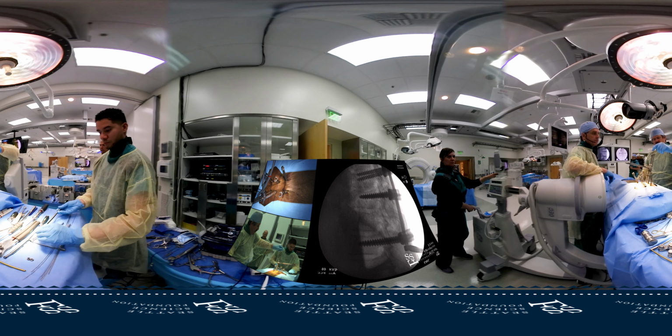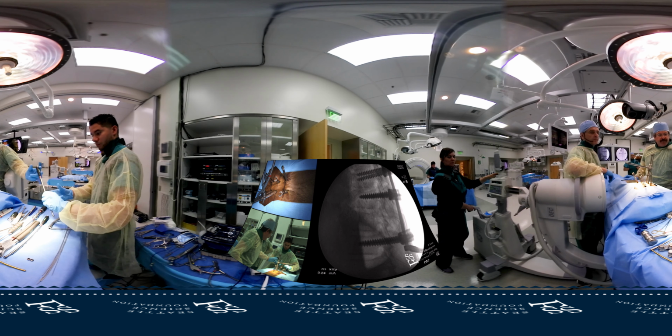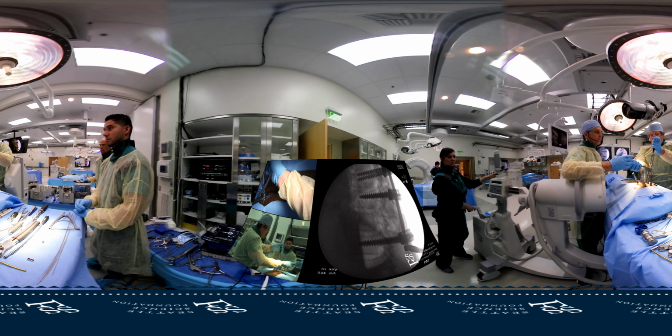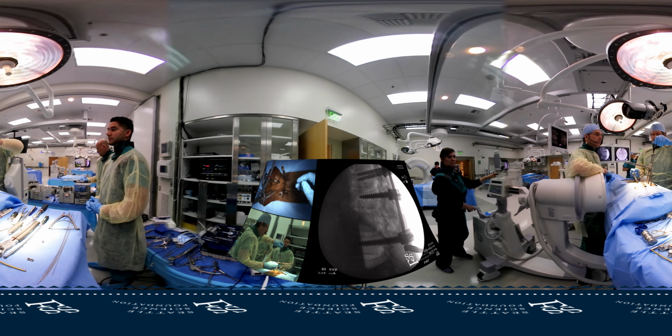And then you could put your cap down. Let me see the cap thing without a cap. So right now we have a cap in here. So if I was going to do this, I could loosen the cap, compress, tighten my cap down, and then we're done.